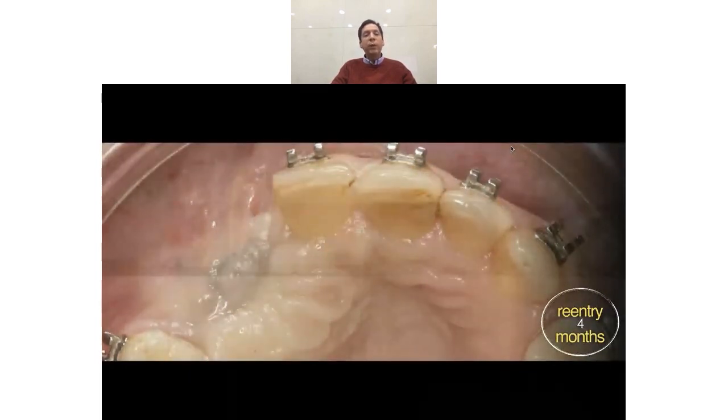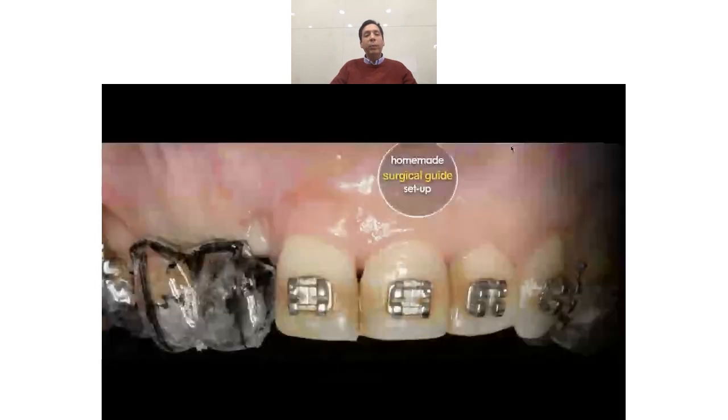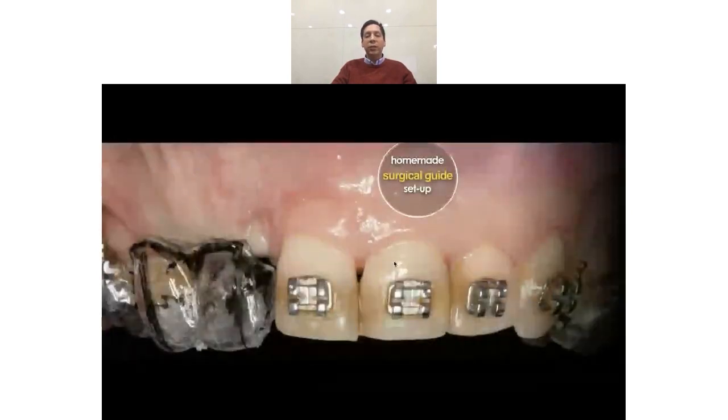Question is, where will we place the implant? There's a meeting between the restorative dentist and the orthodontist, and they made an orthodontic setup, so they can decide where they will place the implant. And here we can see the homemade surgical guide, which is supported by the molar and the premolar because these teeth will not move anymore. Other teeth will be moved, but the second premolar and the first molar will be in that position, so we can support the surgical guide on these two teeth.